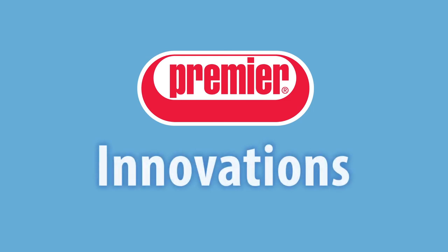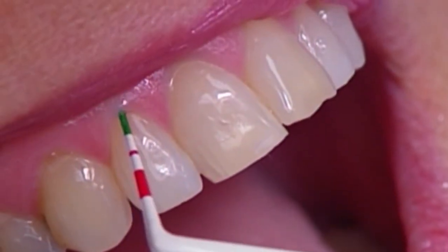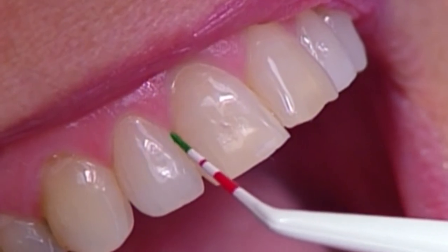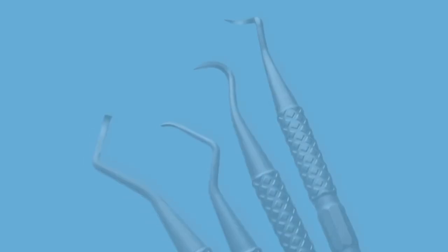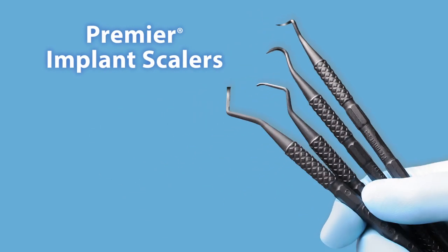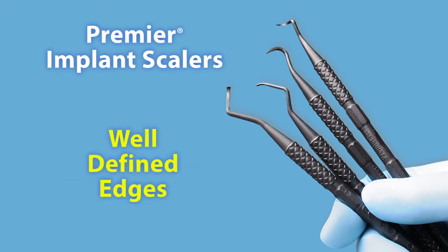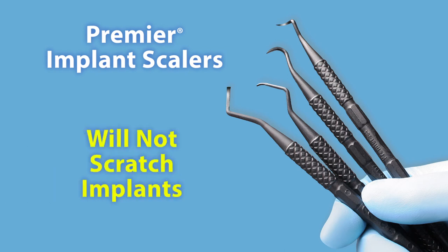Premier has introduced many innovations in the area of instrumentation. These include the novel Periowise color-coded probe, ideally suited for a quick screening or a full examination. Implant scalers made of graphite reinforced resin have thin, sharp tips with well-defined edges to effectively remove calculus and plaque but will not scratch implants.